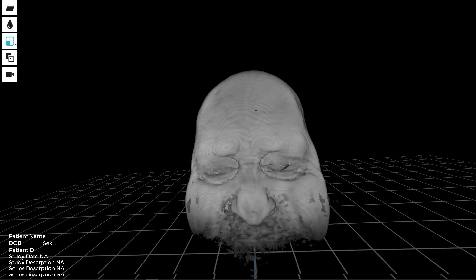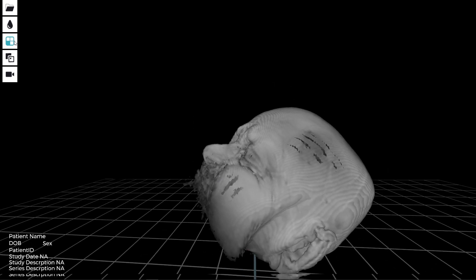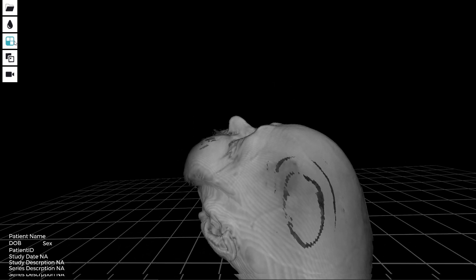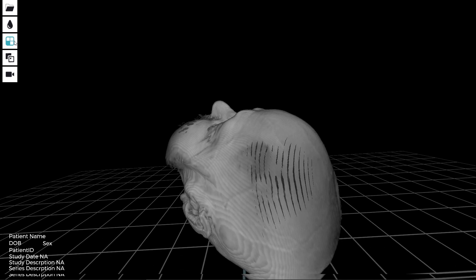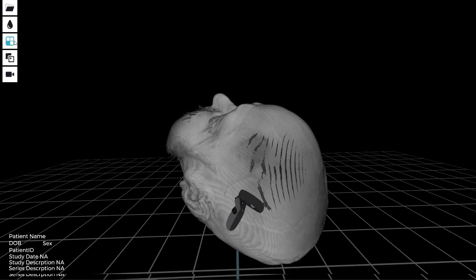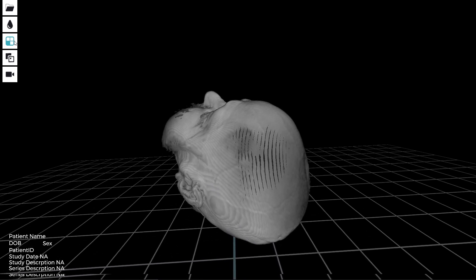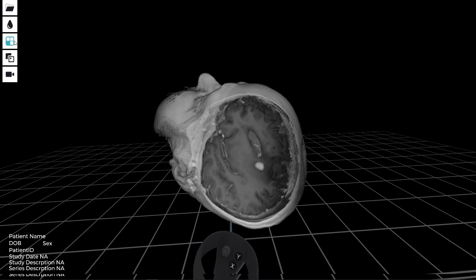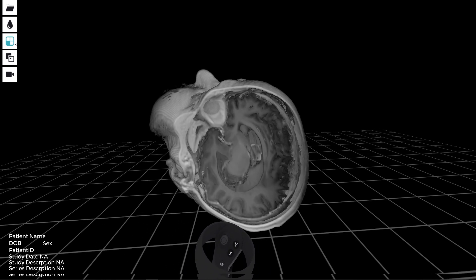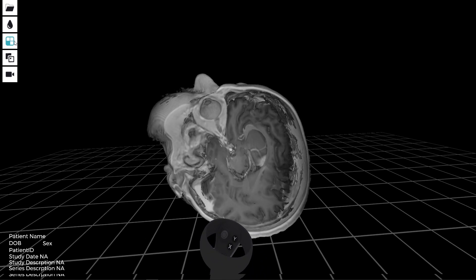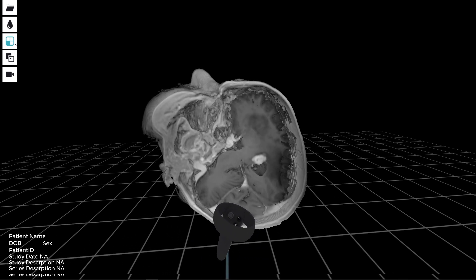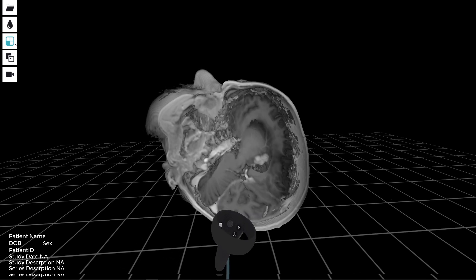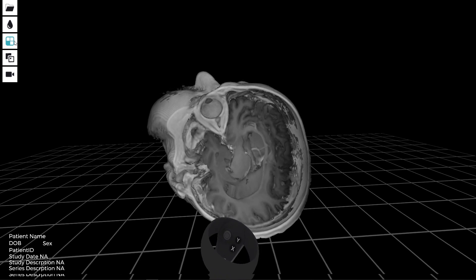With MedVR I can turn the head in any direction, like I would in the OR, and plan my approach with the patient positioned as they would be in the OR. So I have no surprises when I get to the OR and operate on this particular patient.